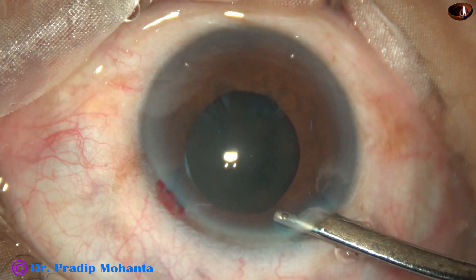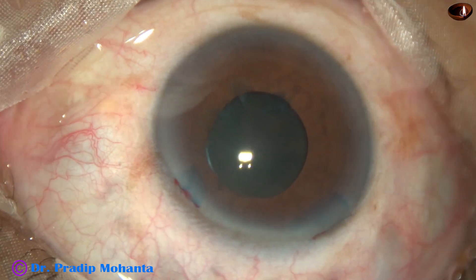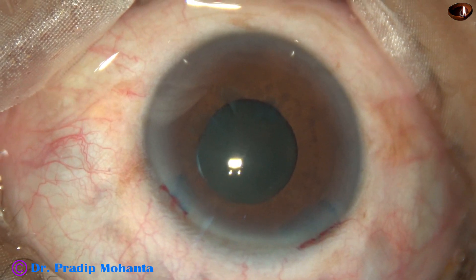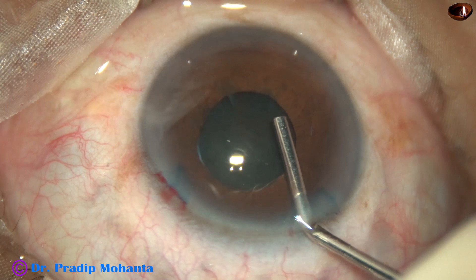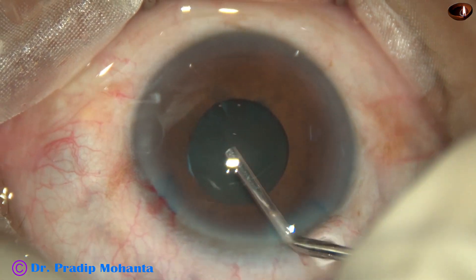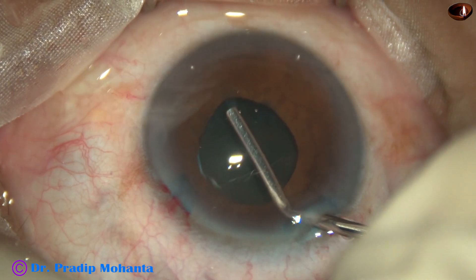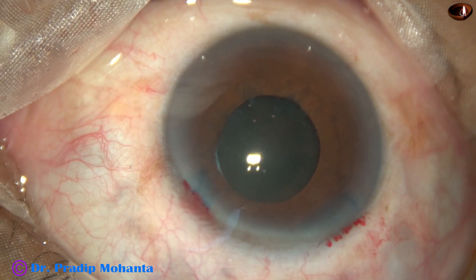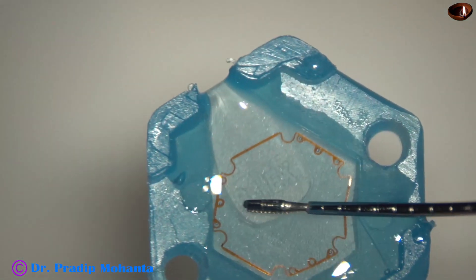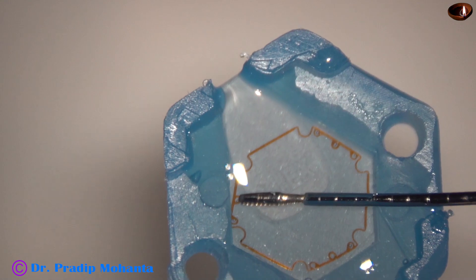By this time, the anterior capsule has been stained with trypan blue dye. Since the cataract is hard, I have already decided to use a pupil expansion device in this case. The anterior chamber is underfilled and some visco has been injected underneath the iris. This is the B-Hex ring.